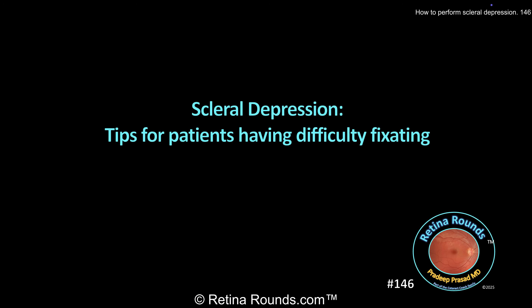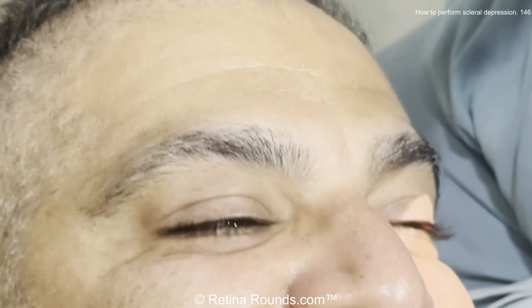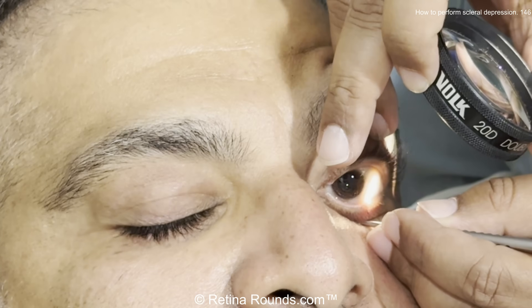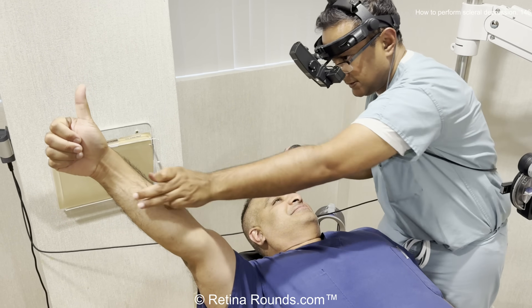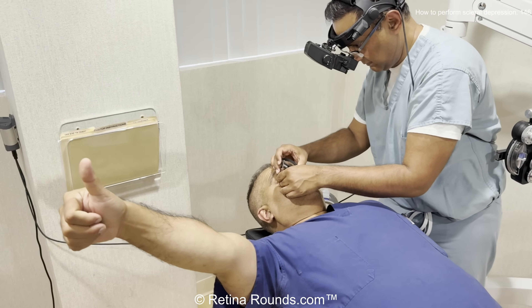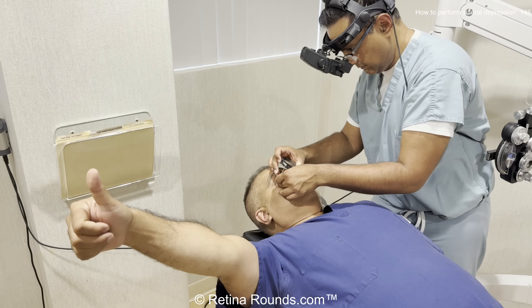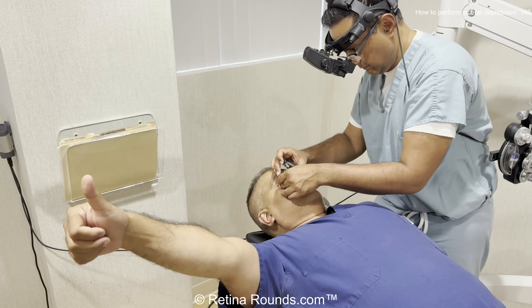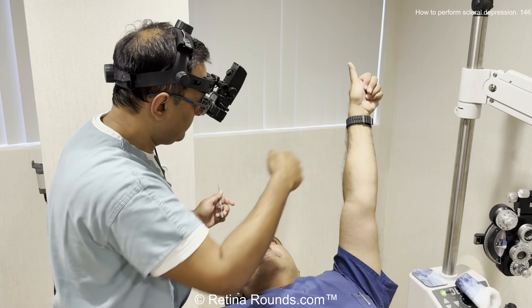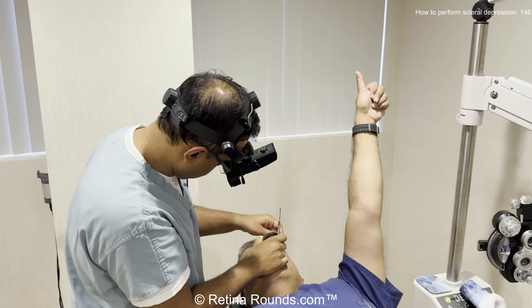How about patients who are having a difficult time fixating? Often this is going to be because the fellow eye is closed. We want to examine at 6 o'clock in the left eye, so we're going to have the patient look up, then look down. You can see as the right eye closes, the left eye starts to roll up — that Bell's reflex kicks in and the eye rolls up. So you always want to encourage patients to keep both eyes open. If they're having a difficult time, one useful strategy is to have them use their own finger as a target to look at. You can position their hand wherever you want. Not only is the finger a target, but they also have some proprioception involved that's going to allow them to better look in different fields of gaze.